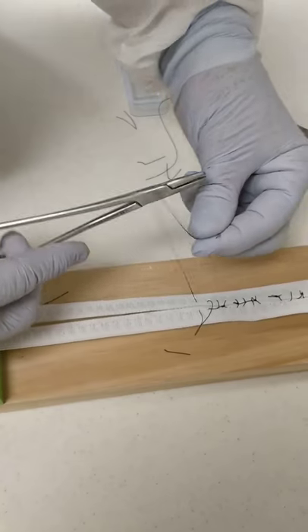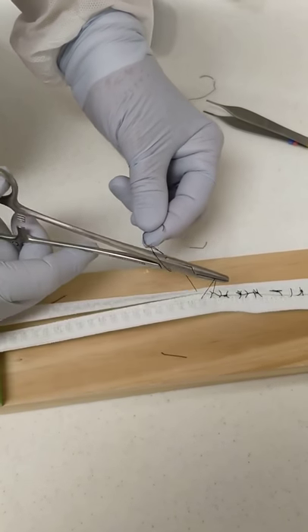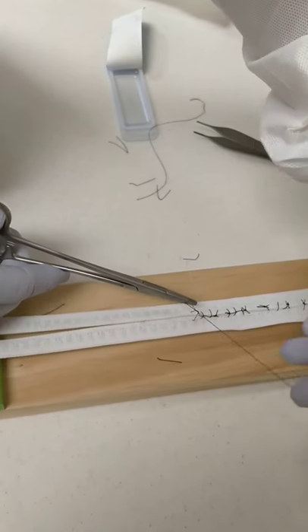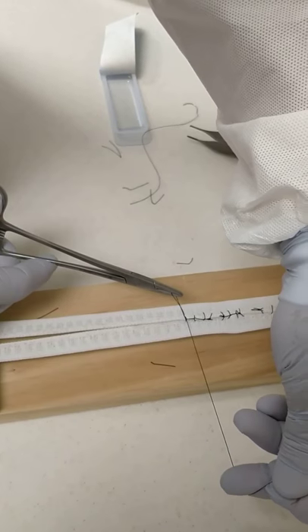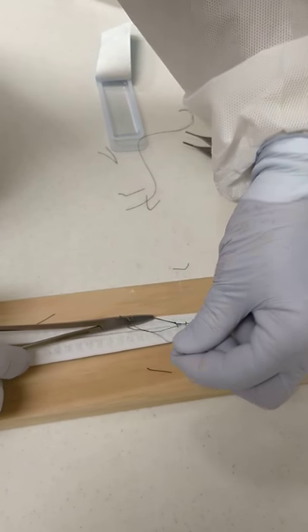And the tie is the same. Go back through, loop to the top part of your loop, clamp, pull together, and finish.